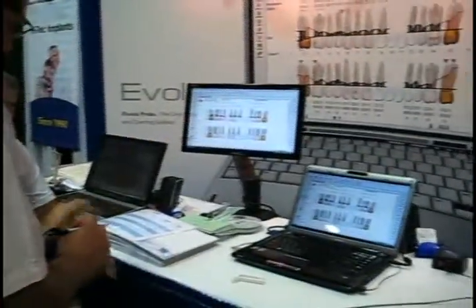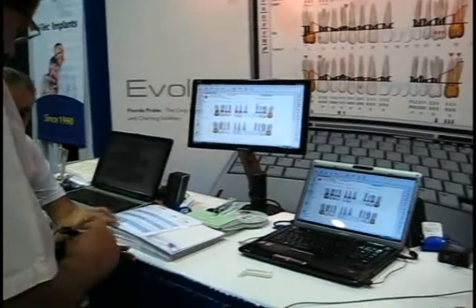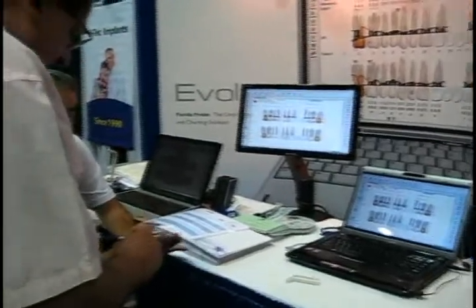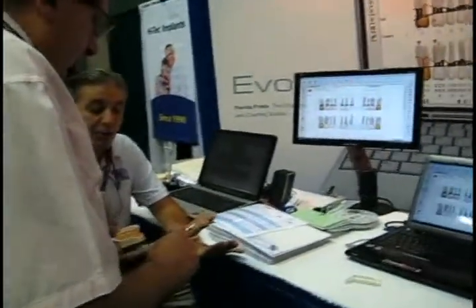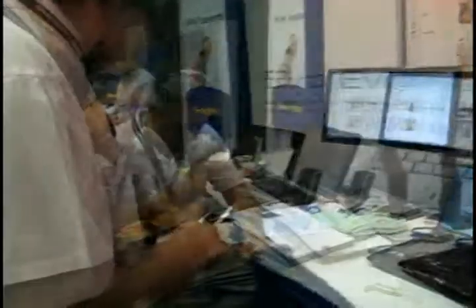First of all, it's a constant force probe — 15 grams constant force pressure. The computer is taking the measurement to 0.2 millimeters.